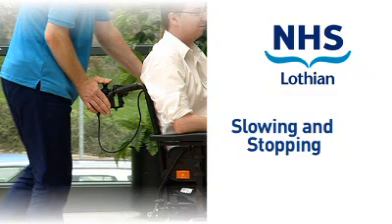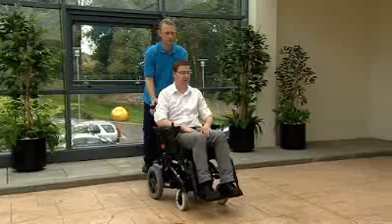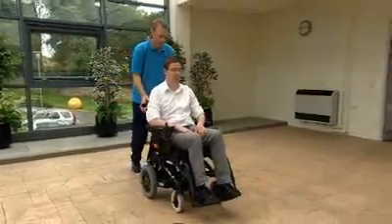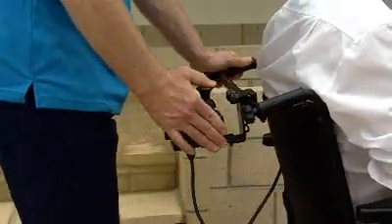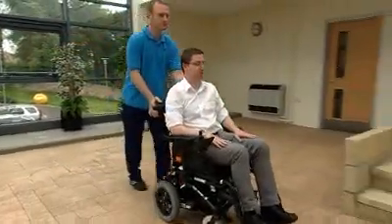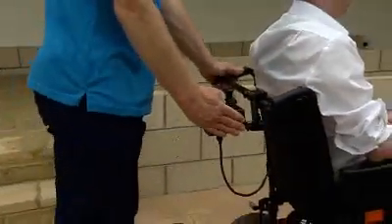Slowing and stopping. The wheelchair will slow down as the joystick movement is reduced and will stop when the joystick is allowed to return to its mid-position. During stopping, continue to grip the push handle and controller until the wheelchair has stopped. At this point you will hear the click of the brakes re-engaging. In the event of an emergency, let go of the joystick and the wheelchair comes to an immediate stop.